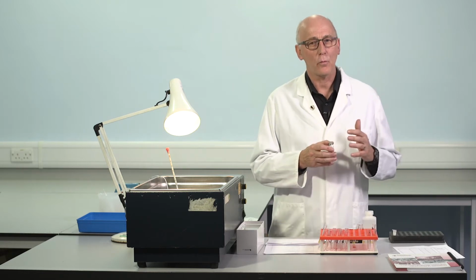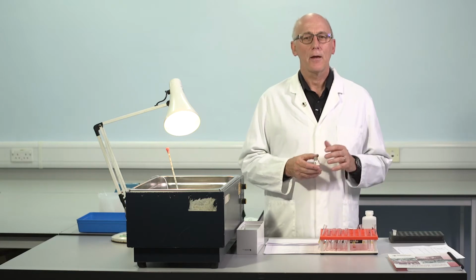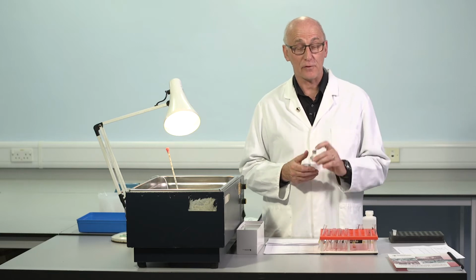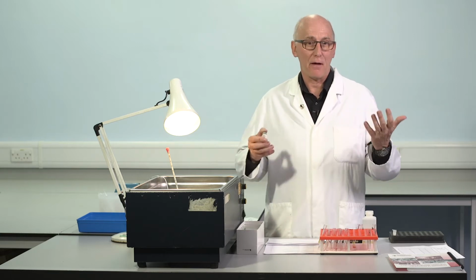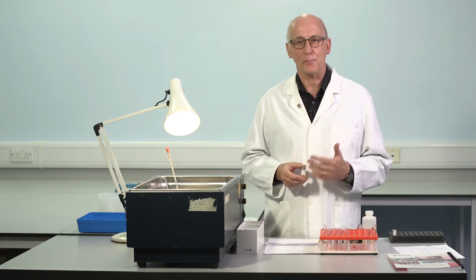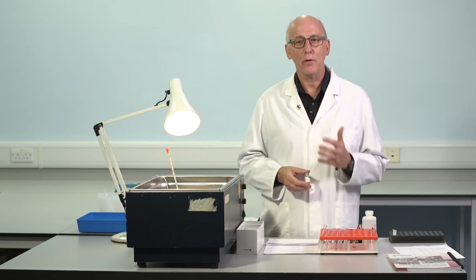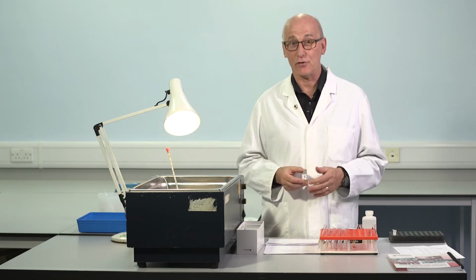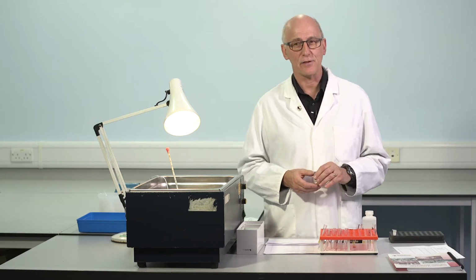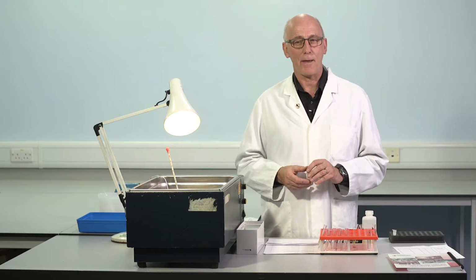It means that we're calibrating in international units, and that's really important. So we begin with a commercial reference plasma like this. We buy that from a particular commercial company usually, and it comes with a labelled potency. A potency for factor VIII, and we should work only with materials calibrated in international units, and if a manufacturer doesn't do that, I don't think we should use that material. The majority of commercial standards are calibrated in this way.